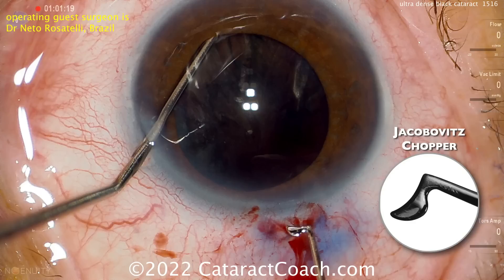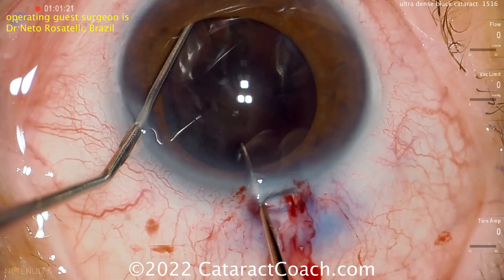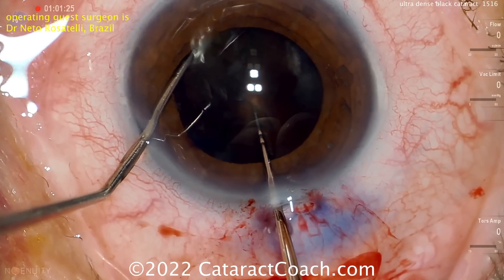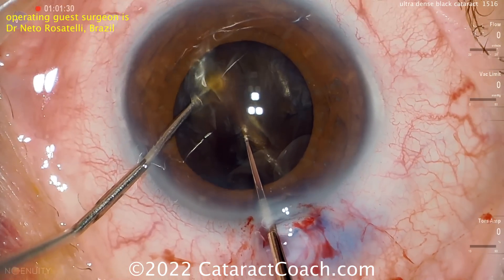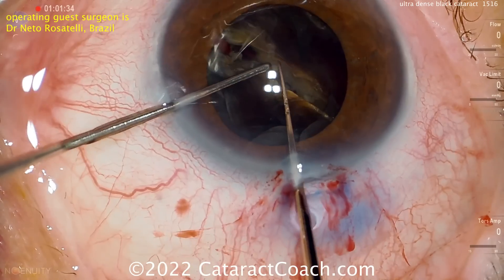The chopper will be placed sub-incisionally and then pushed towards the other instrument in the eye, basically actively and sharply slicing and breaking this nucleus into two halves. You have to have the correct balance so these two instruments can come together, and then once you've done that it can be pulled apart to split this nucleus.